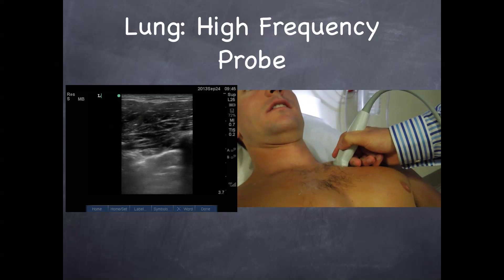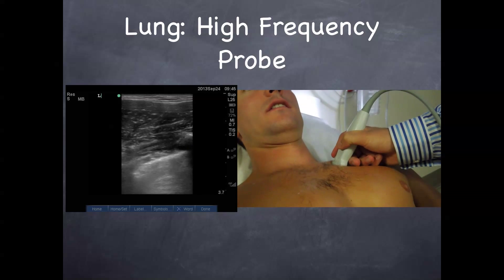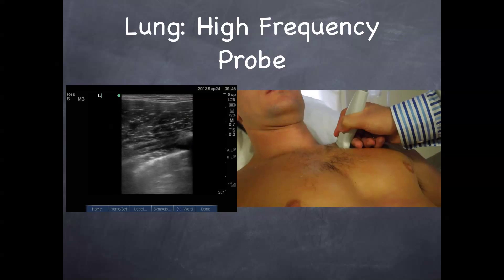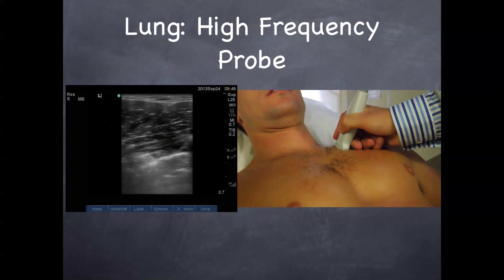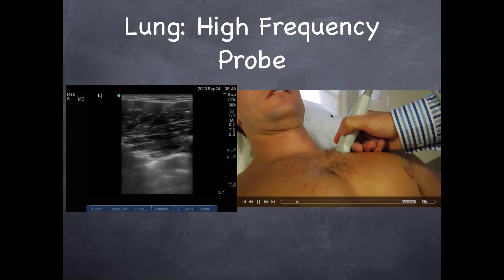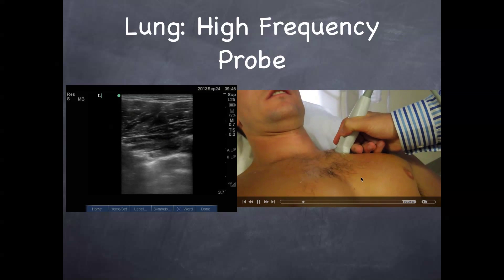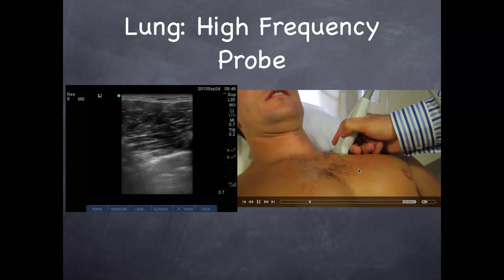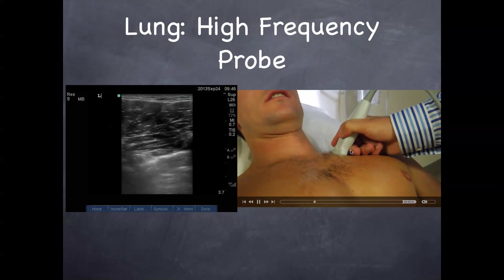Here is the utility of lung ultrasound in terms of finding lung sliding. It can be done in a second or two and can rule out a pneumothorax better than a supine x-ray. You always want to try to use the anterior portion of the chest — it's where air rises. So if you have a pneumothorax, the most sensitive areas are going to be parasternally on the left and parasternally on the right. The left can be tricky with the heart, so Scott here is moving up towards the clavicle to gain this image.